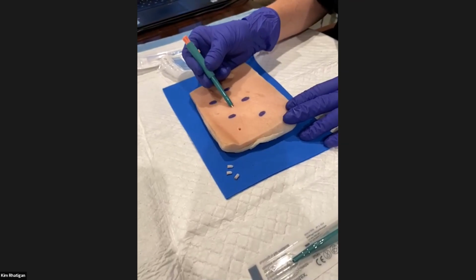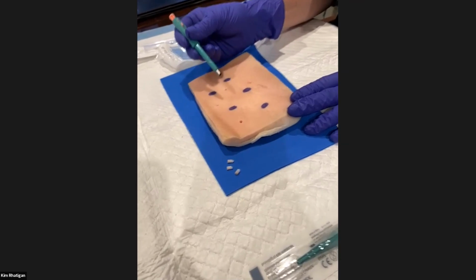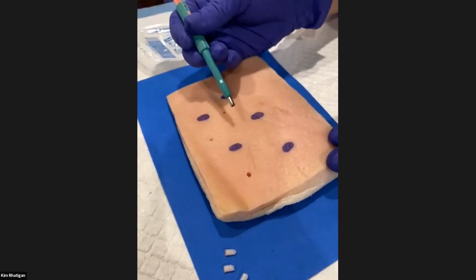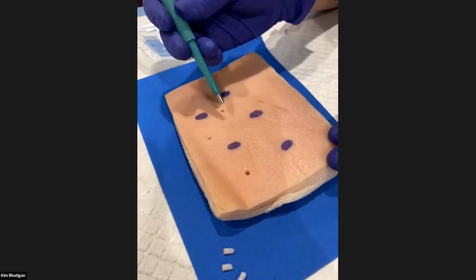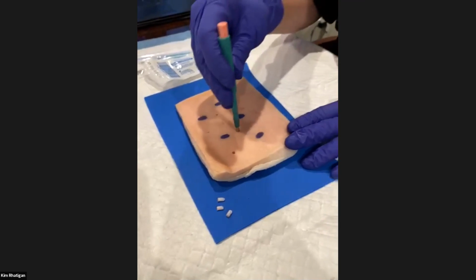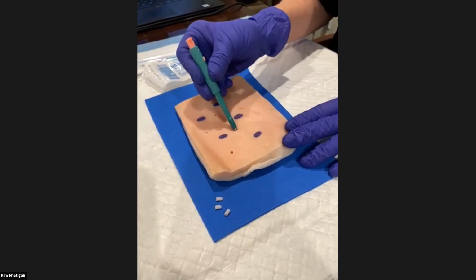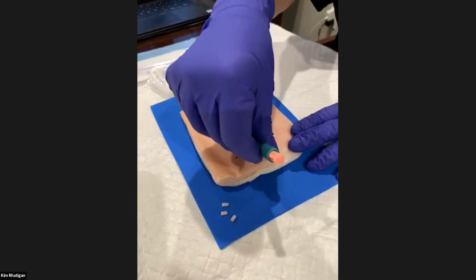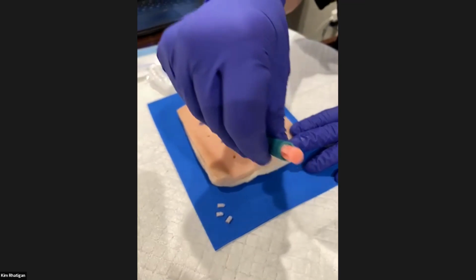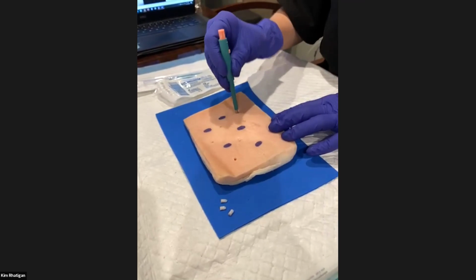I find that the biggest help is the twists. The twisting helps cut it up. Now that guy got stuck. So I would take a forceps or my blade and try to lift it out, but he's stuck in the skin right now. And remember also this punch is going to start getting dull from the skin. So the more you do, the duller this blade gets. Let's go here. Oh, he's stuck too. This is good.